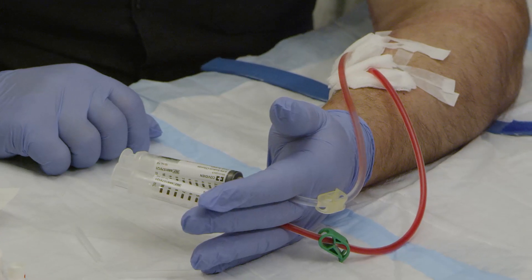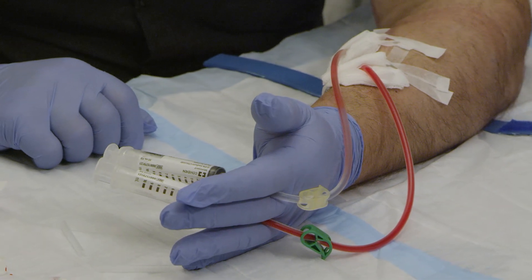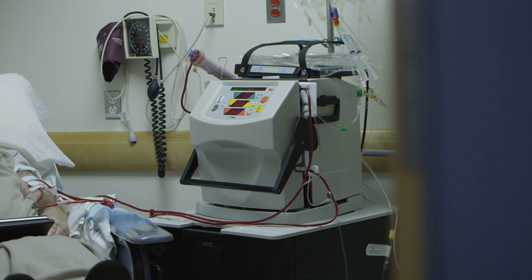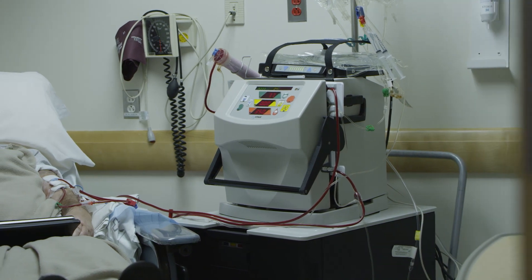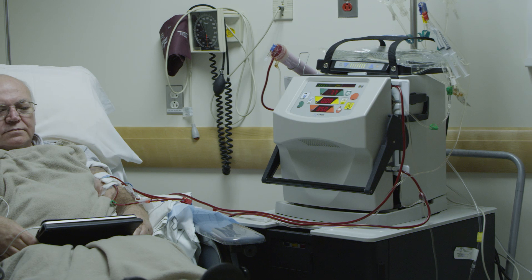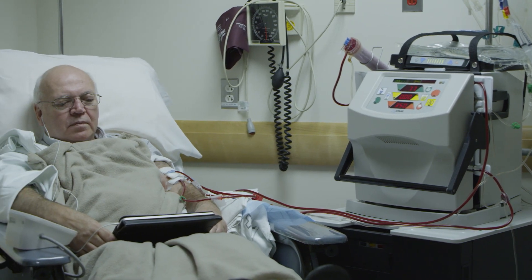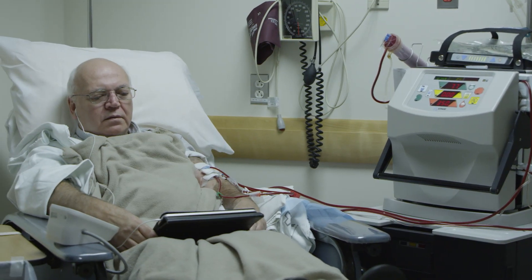The fistula is usually placed in the lower arm, but can also be in the upper arm or thigh. Fistulas are the access of choice because they have less chance of clotting and infection, less hospitalization due to access issues, and may last longer than other types of access.